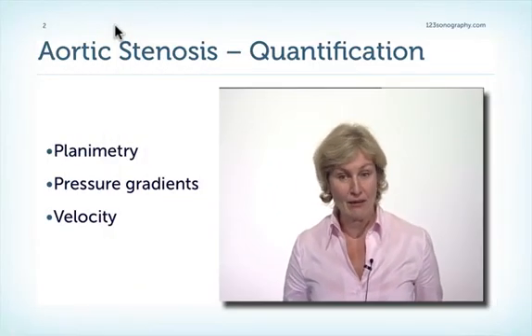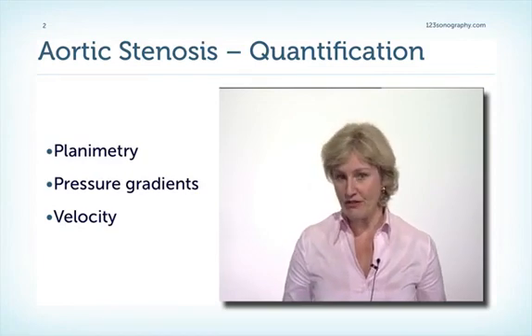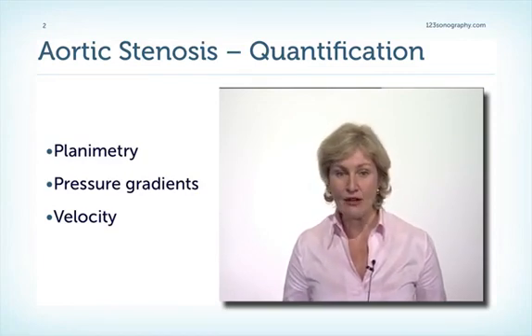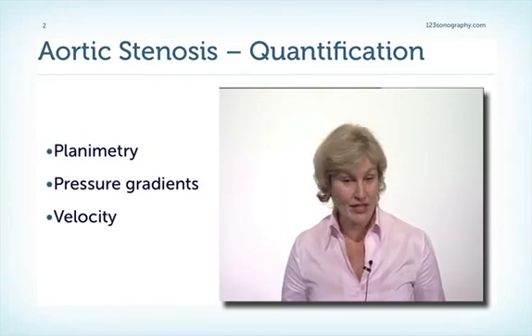Welcome back. Now we will look at the quantification of aortic stenosis, and the most important tools are planimetry, the pressure gradients, and the assessment of the AV velocity.